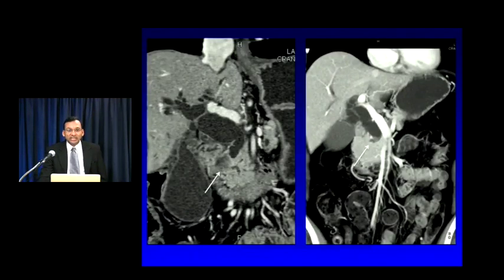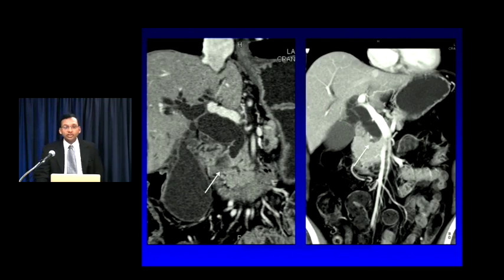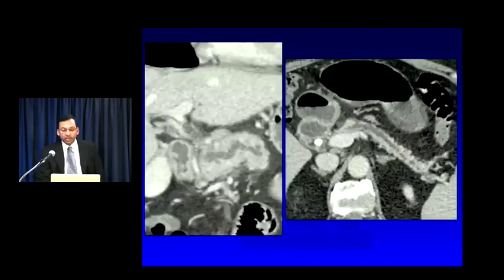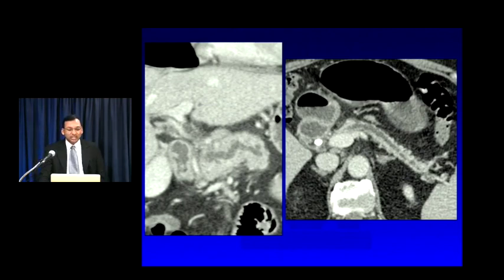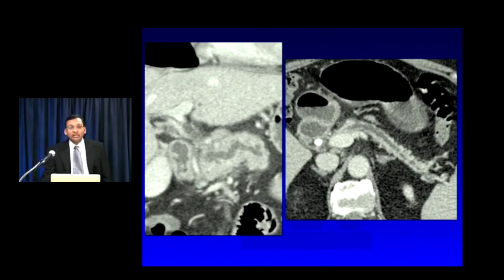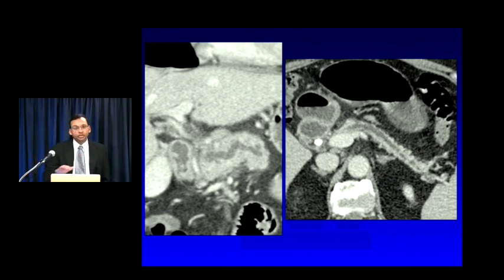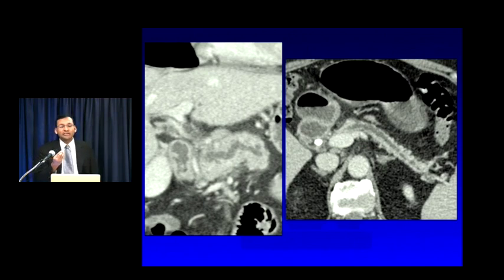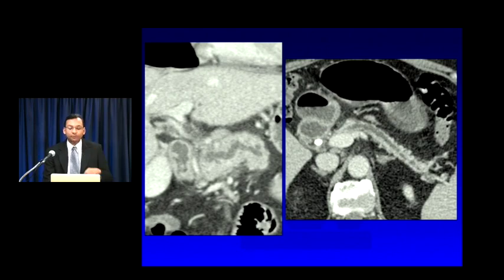Here's a classic example — a hypodense mass with abrupt cutoff of the distal common bile duct. Even if you didn't see the mass, the duct morphology should raise concern for an occult neoplasm. Here's another case where no primary pancreatic mass is visible, but the pancreatic duct is dilated with abrupt cutoff at the pancreatic neck. That patient needed endoscopic ultrasound and was found to have a sub-centimeter adenocarcinoma. Never let a dilated pancreatic duct go — that must be further interrogated.